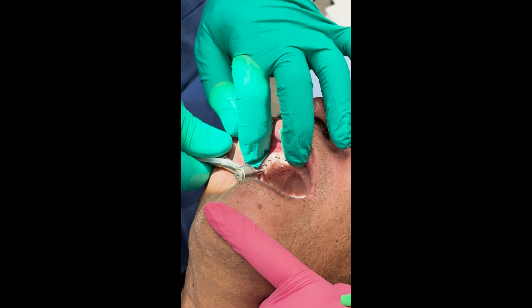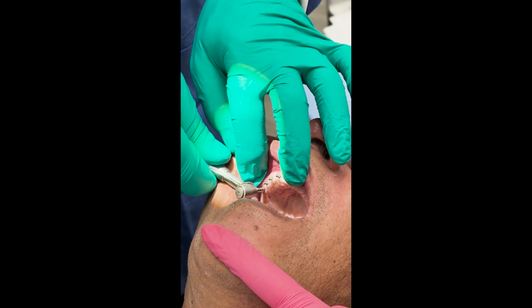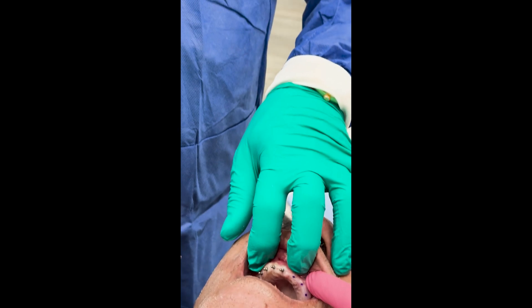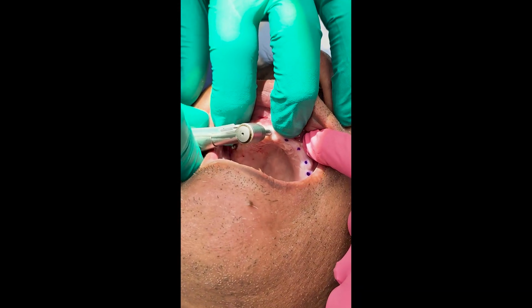We got a beep — that's good. So we got the first five implants in place. I'm going to bury this front one just a tiny bit more at 60 newton centimeters.